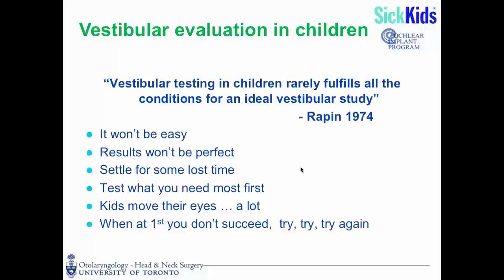So truly the bottom line is that it's not going to be easy. It'll be a challenge, but a fun one. The results won't be perfect. We're going to have to settle for some lost time. You're going to test what you need most first, and kids move their eyes a lot. I've spoken about this already. They like to look all over the place, so you're going to have to focus and refocus them. And certainly when at first you don't succeed, you just need to continue to try again, and eventually it will come. And what a joy it is when you are able to get useful information out of a child.